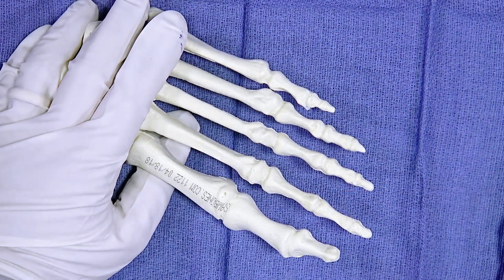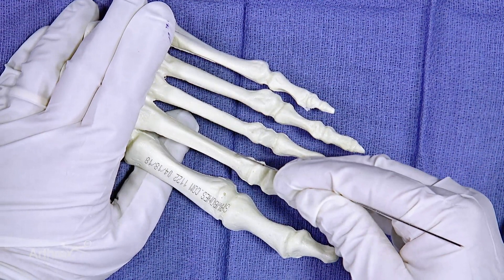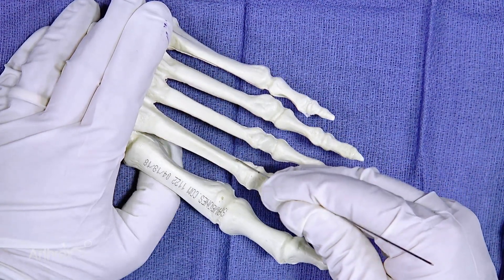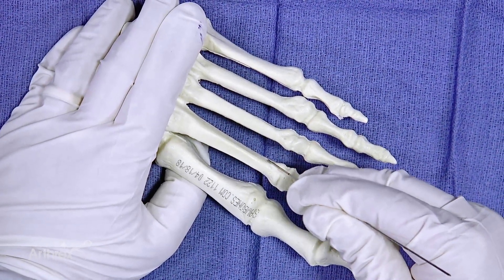Today we're going to demonstrate the distal metatarsal metaphyseal osteotomy, or the DMMO. We're making the incision just lateral to the extensor tendon, right about here.